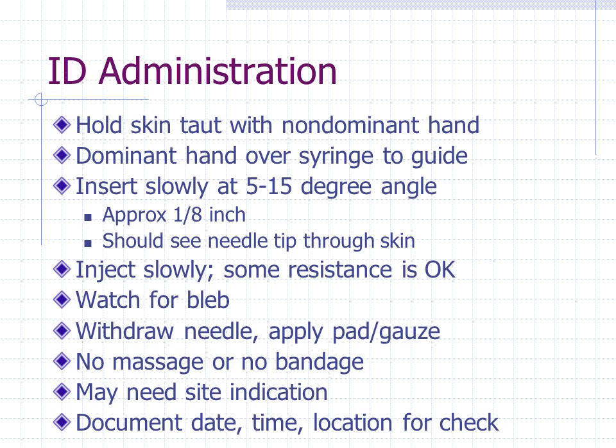You will, for especially very thin-skinned people, see the needle tip. Inject it slowly. Some resistance is okay. Remember, you're just going barely under the skin. Watch for that bleb. Do not massage or place a bandage on it.